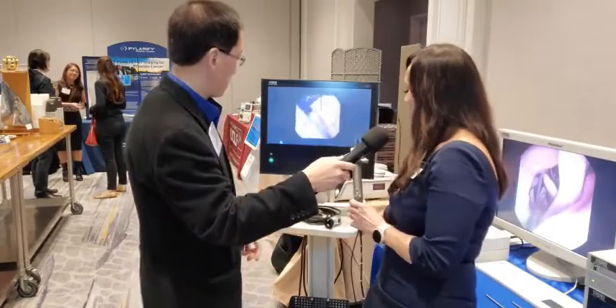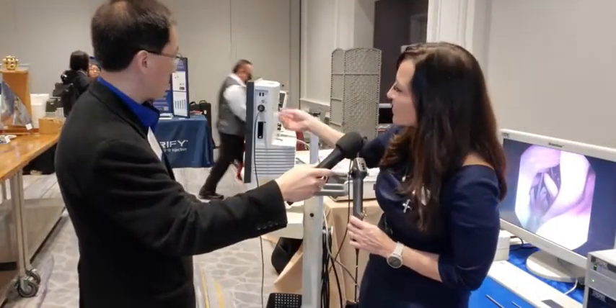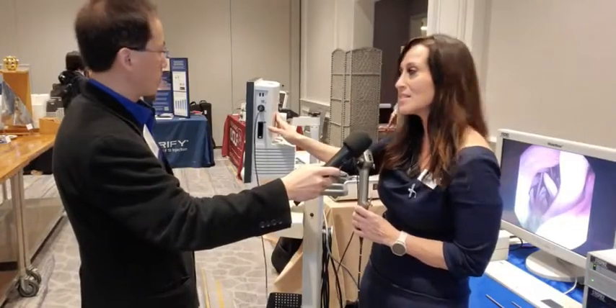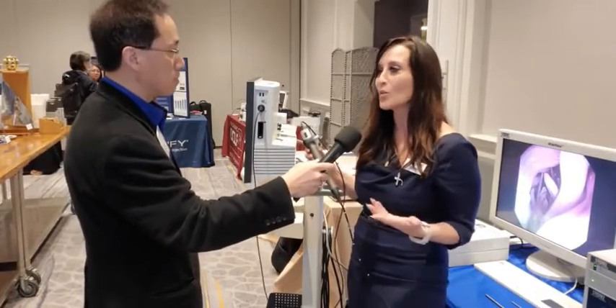The cart has a smaller footprint than our typical OR setup. You've got your inputs here on the side — our single-use ureteroscope plugs into this system, along with our digital flexible ureteroscope and our cystoscopes. So it's really an all-in-one solution.